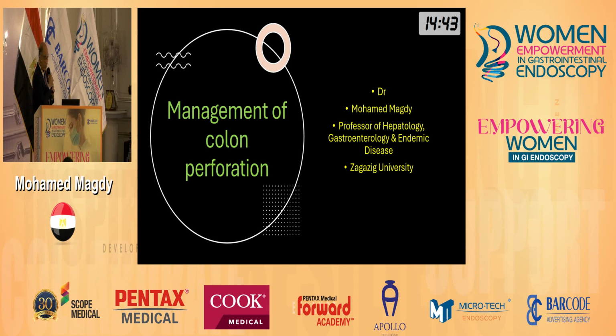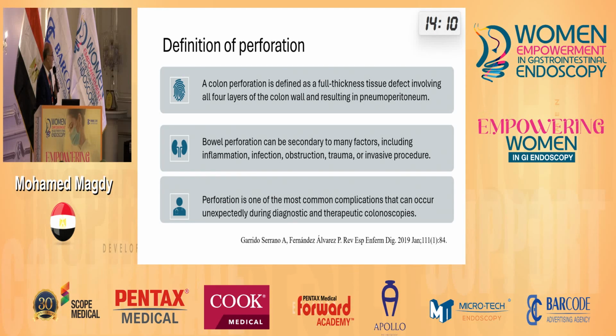Today I will talk with you about one of the nightmares for endoscopists: perforations. Perforation is a situation no endoscopist wants to be in at any time, but it is a known complication in all GI endoscopy, upper and lower. Today we will try to discuss colonic perforation. This is our objective today.